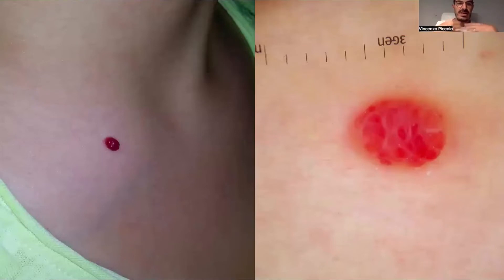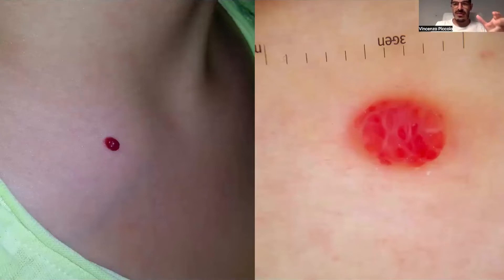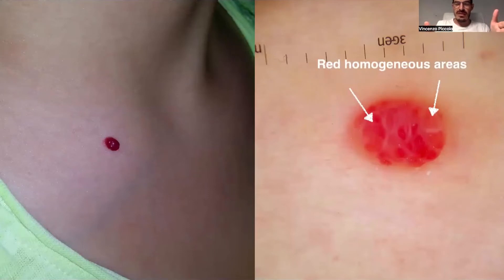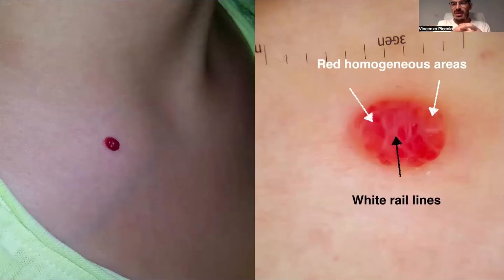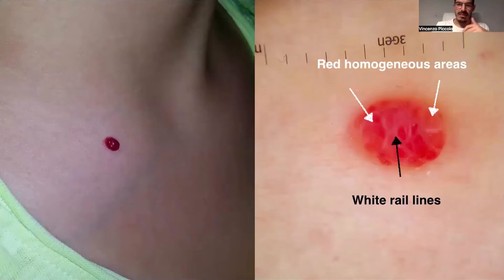In this other case, affecting the chest, the clinical appearance is quite the same, but at dermoscopy we see different features: multiple red homogeneous areas rather than a single one, and white rail lines at the periphery of each lacuna. This is a very common dermoscopic finding in pyogenic granuloma and we should keep it in mind.